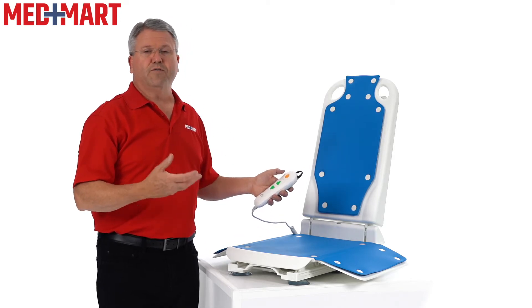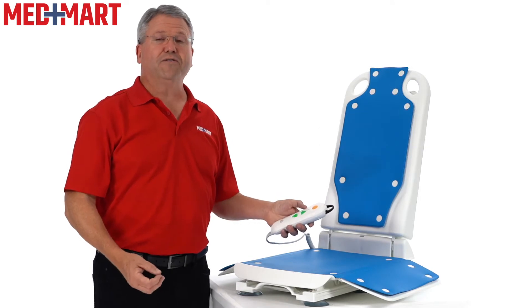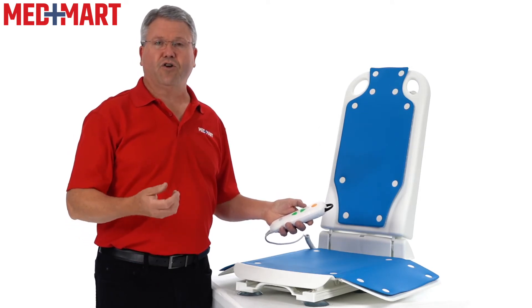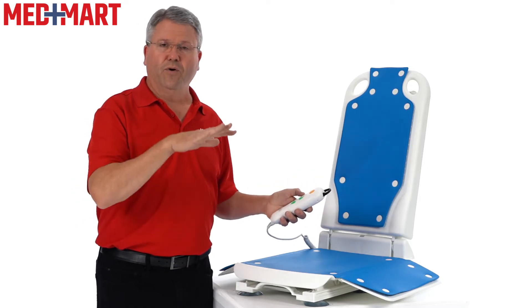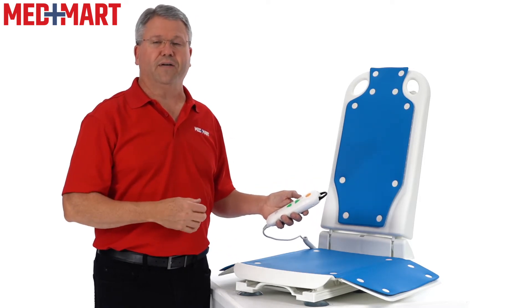The battery supports up to about 30 baths. If for some reason you don't have enough charge to take you all the way down and back up, the hand control won't even work at that point. So if it won't lower you down, that means your battery definitely needs to be charged.